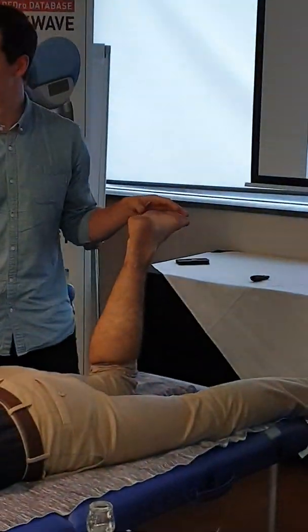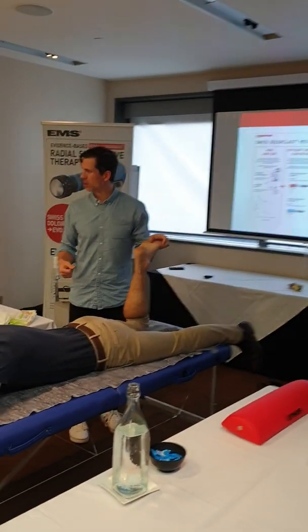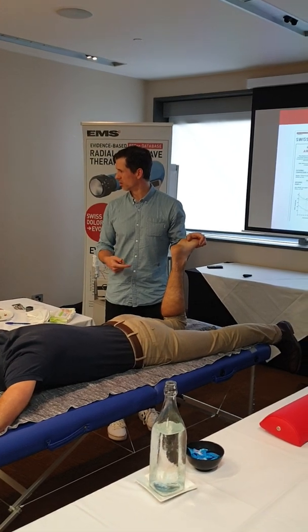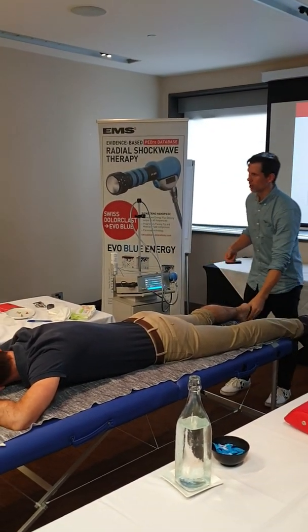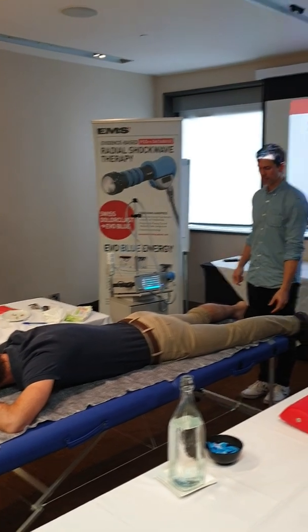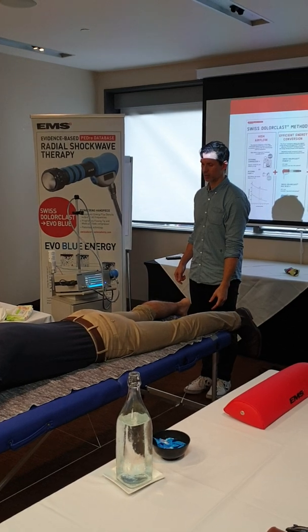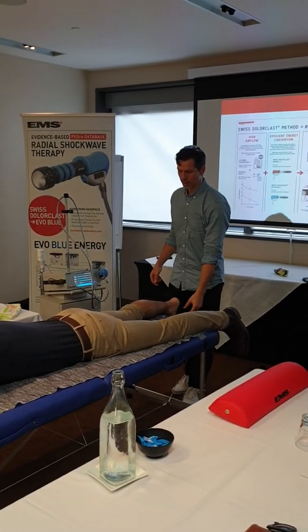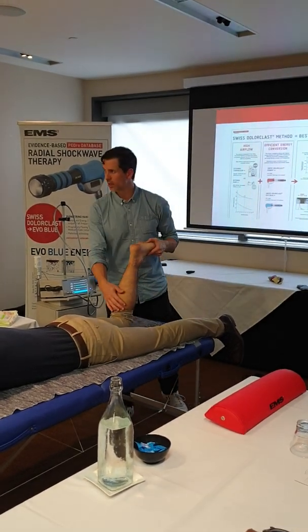Sorry to interrupt. Is there a reason why you keep the knee flexed a little bit? Because it's easy for me to treat. If you're sitting on your bottom you can just lay it like this. I just find this is easier. I've got a little pillow, and my table's lower, so I sit on the floor, or I have a little stool as well. I've got a few different things, but I find this also takes some of the tension out of the calf.